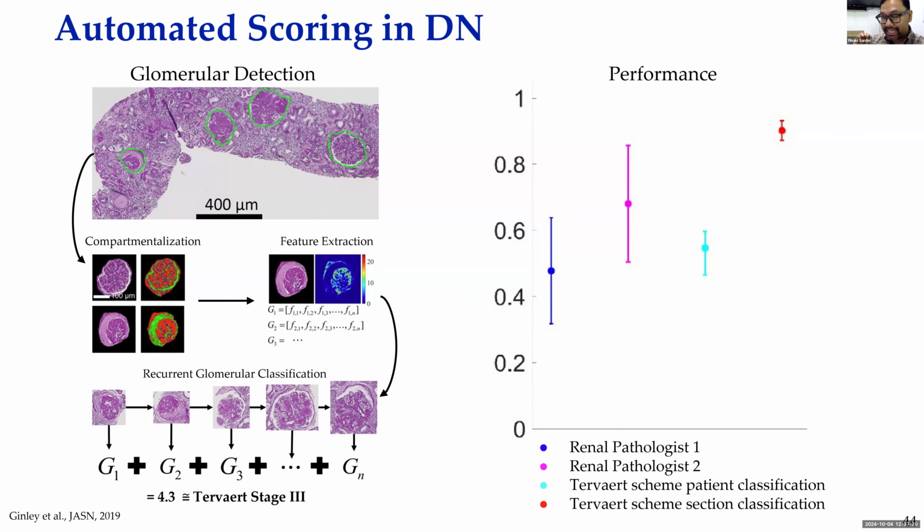So what we did, we compared these two data sets from these diseases with minimal change disease to create a classifier using features which would apparently tell us there are nodular changes. But then we used all the features to refine that classifier and asked the AI to tell us, once we define that classifier, what features are abundant in each of these classes.